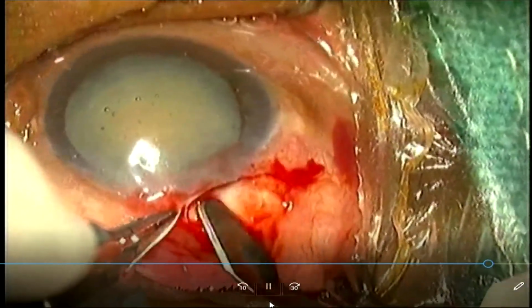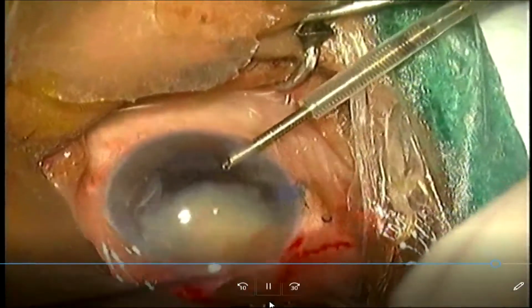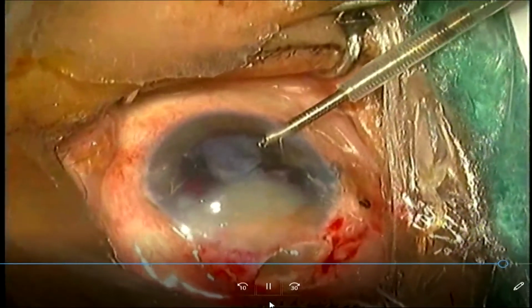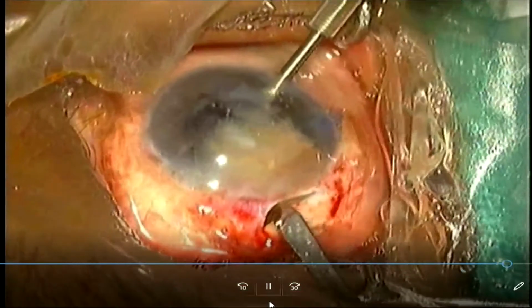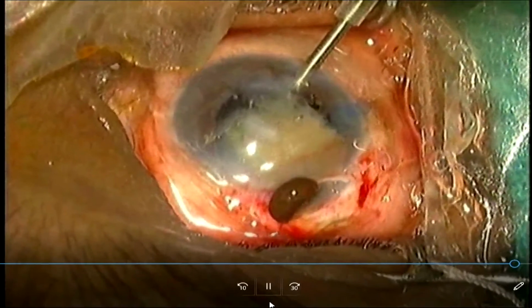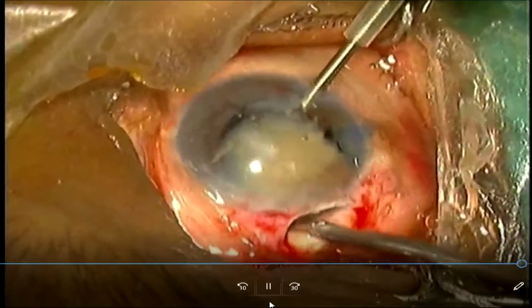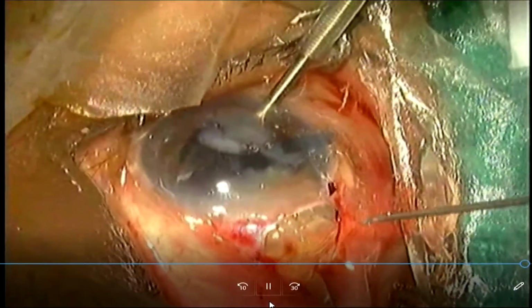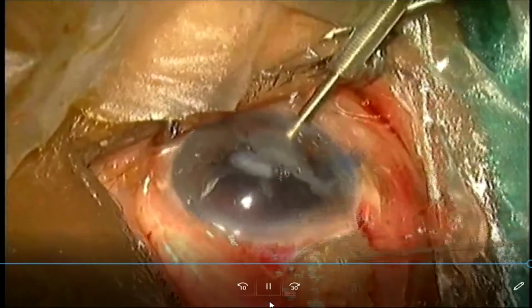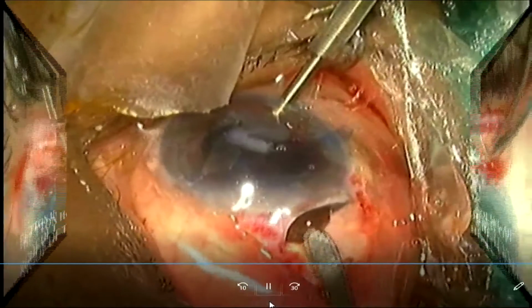Now this is another case where again there is a premature entry, and while the nucleus comes, it has a tendency for the iris to get incarcerated beneath the nucleus. So if your nucleus is not progressing and you have a doubt that there is a premature entry, then don't try. This is what you should not do. See what is happening now. So you just push back the nucleus, put in viscoelastic, re-engage your nucleus and then take it out. Otherwise you will end up with a superior iridodialysis if you keep on doing this.